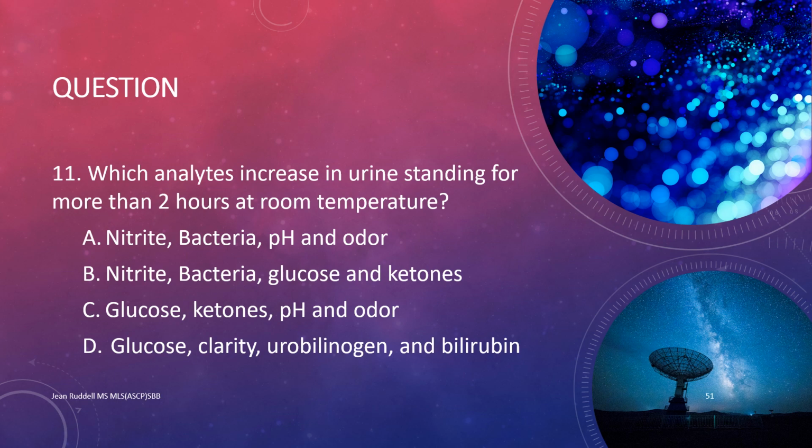Question 11. Which analyte increases in urine standing for more than 2 hours at room temperature? A, nitrite bacteria, pH and odor, B, nitrite bacteria, glucose and ketones, C, glucose, ketones, pH and odor, D, glucose, clarity, urobilinogen, and bilirubin. The answer is A, nitrite bacteria, pH, and odor.